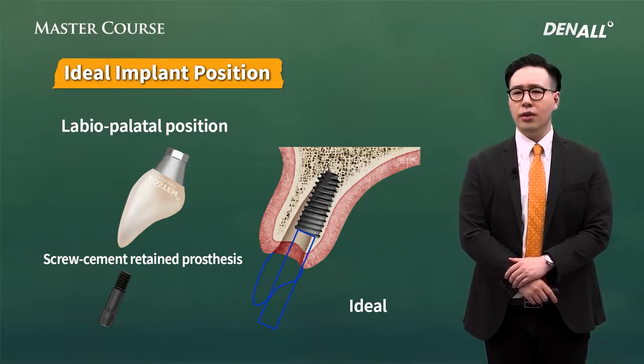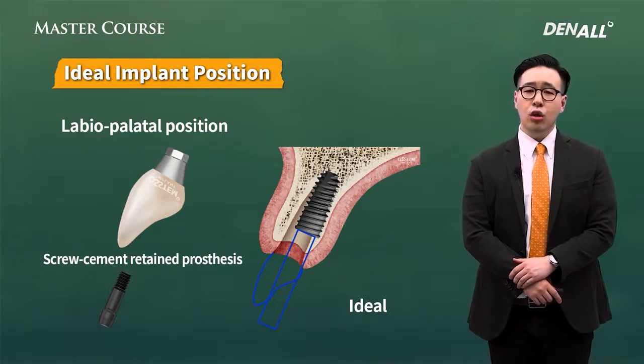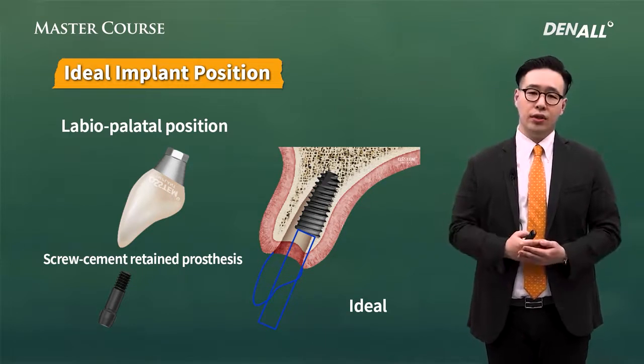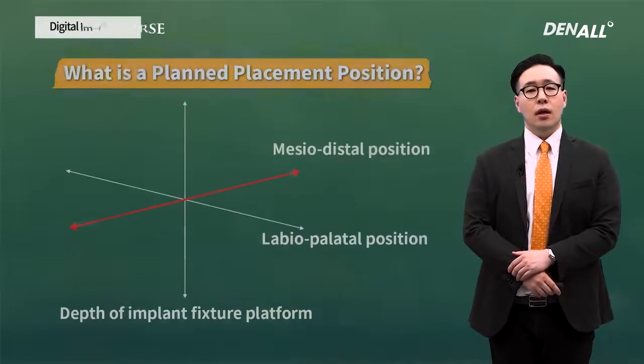So much more precise treatment planning is possible. Surgery can be done accurately and fast. Before surgery, a temporary prosthesis can be prefabricated. That's like killing 3 birds with 1 stone.